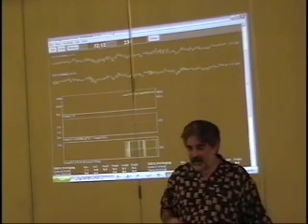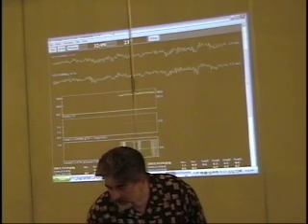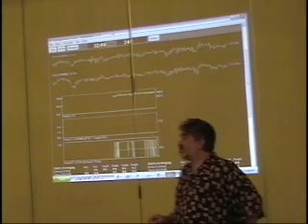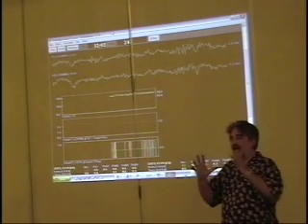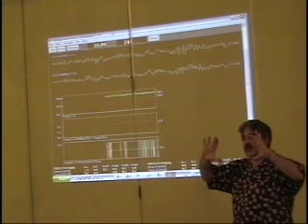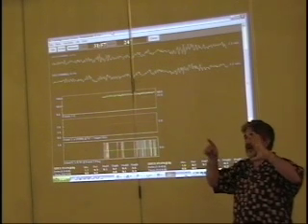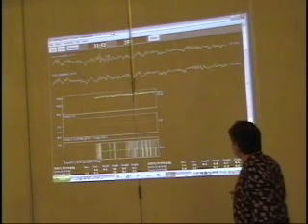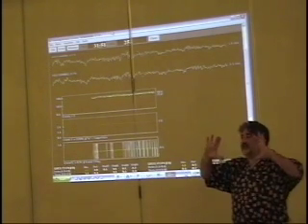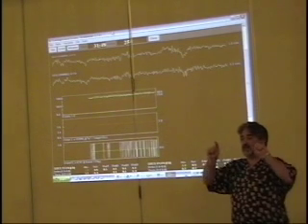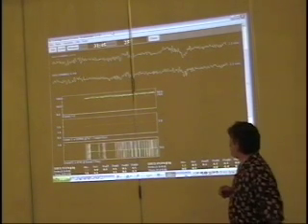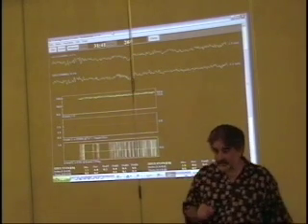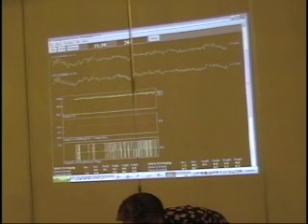What I'm going to do is back up one. There we are. So we're just feathering the feedback so that now we know that the size of the target that's discriminating that 10% of the Z-scores being affected is now 1.9 standard deviations as an instantaneous deviation. That's really the only thing that needs to be adjusted. Now the feedback's around 75%, which is a very workable level.